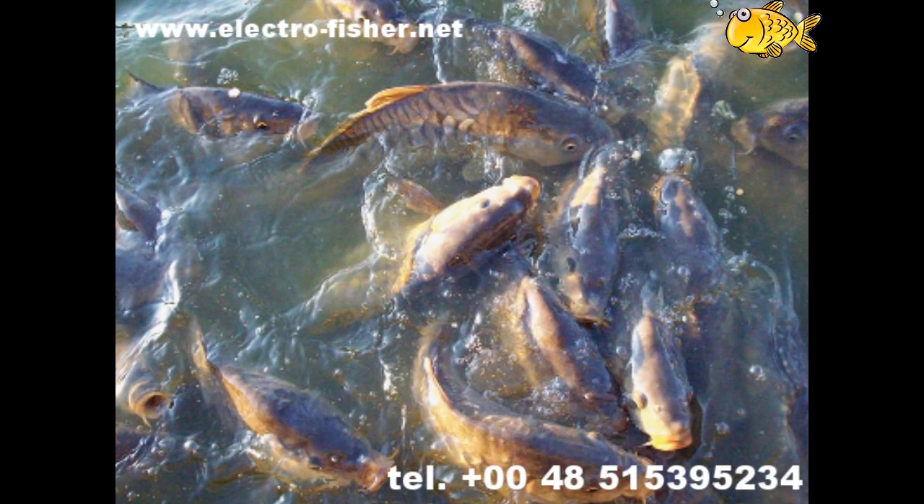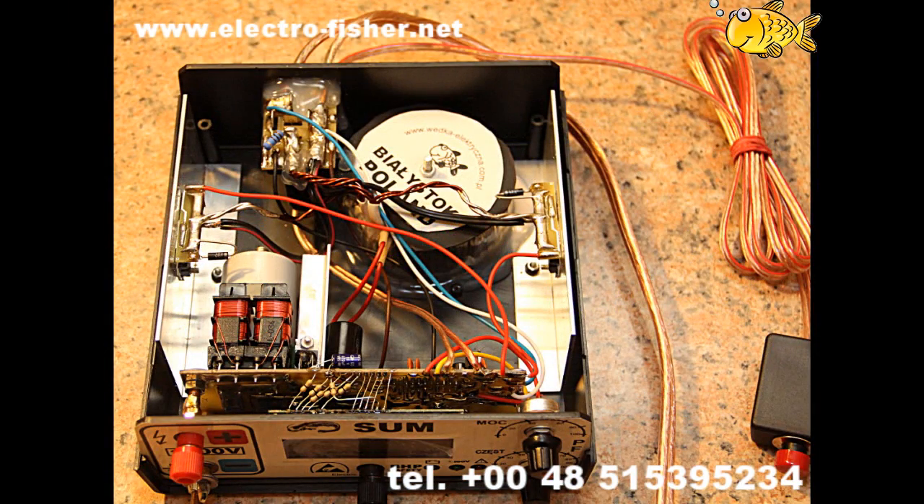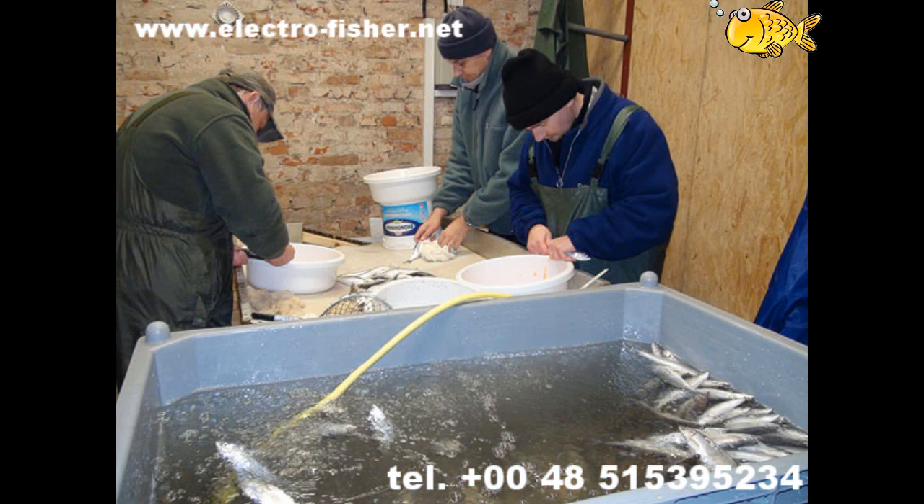Fish electro-narcosis. In other words, electro-narcosis is lulling the fish with the help of electric current. This film aims to show that a specially designed device can be used to stun a fish without harm.